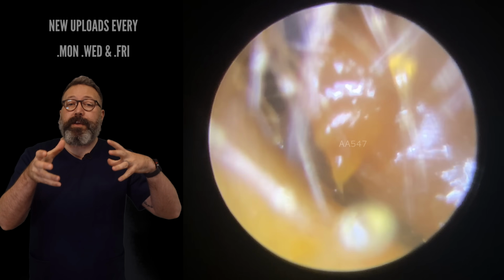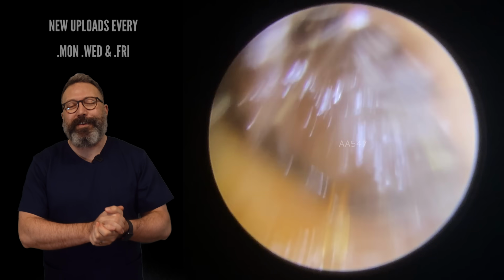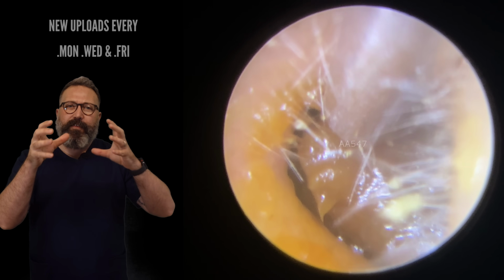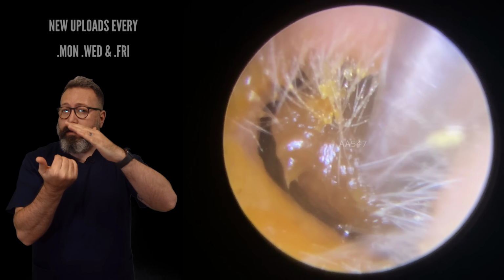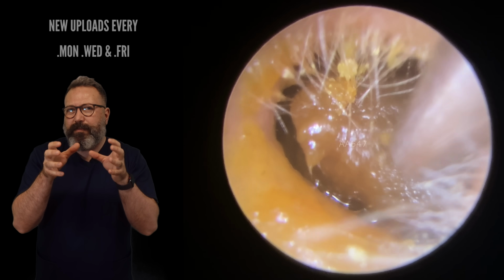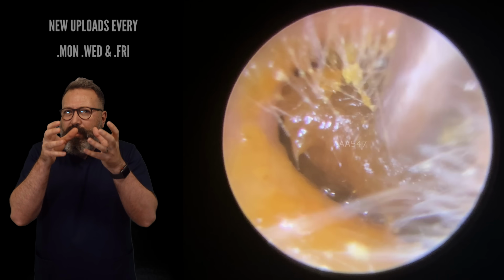So this patient's come through, as always, feeling very blocked up in their ear canals and not hearing particularly well. But what you can see here is we've got this kind of slightly tougher bit of wax. Now, it looks really soft at first glance, especially because I can see a lot of oil sandwiched between the canal wall and the block of wax there as well. But when we get a grip on this, I can see it's actually a little bit tougher than I thought it was going to be. But there is a little bit of movement there, so it's not completely solid.